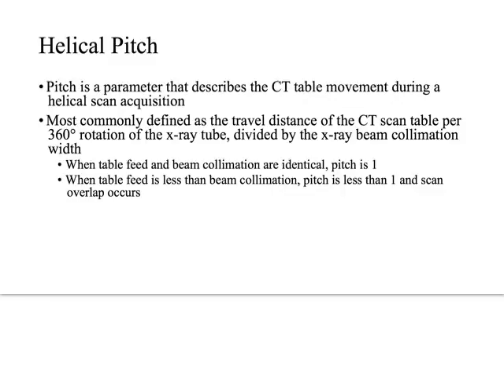If the table is moving faster than the width of the slice, then we will have a pitch greater than 1. And that's when we will start to lose some data, or we'll start to see blooming and things like that. That being said, on page 54, she says that the most common pitch is between 1 and 1.5. It's in the key concept box.